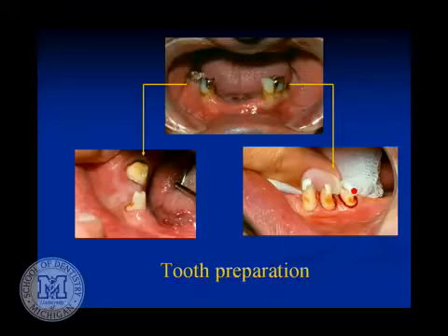They were near mechanical exposures. They weren't mechanical exposures, making room for everything. So that when I went ahead and got things all cleaned up, you'd see a little tiny dot of blood that would form over a period of about 10 seconds. And if you blotted it off with a gauze, it would be nice and clean, and after about 10 seconds, again, the teeniest little drop of blood would show again.